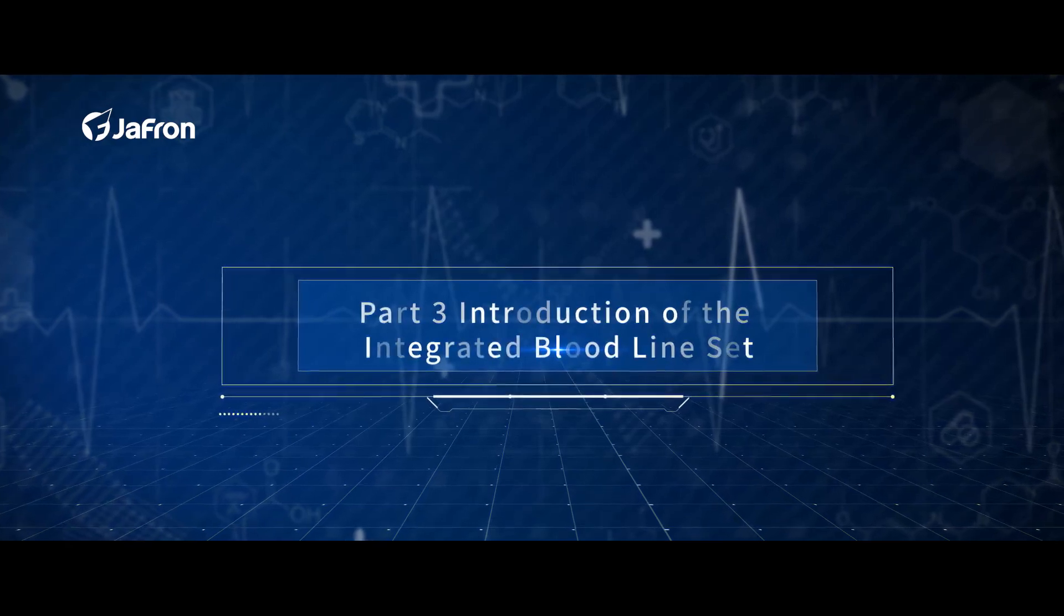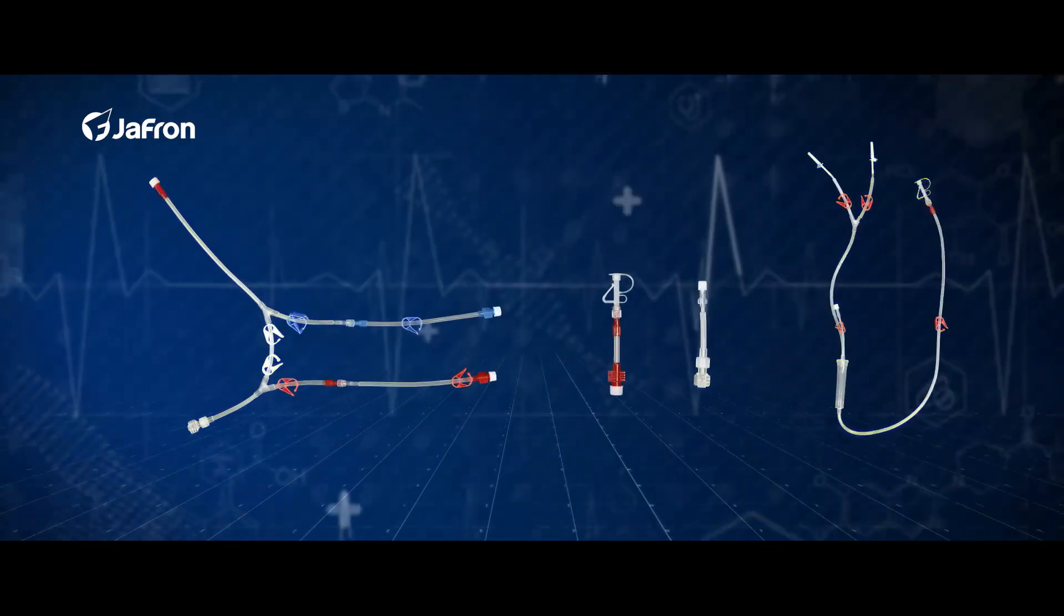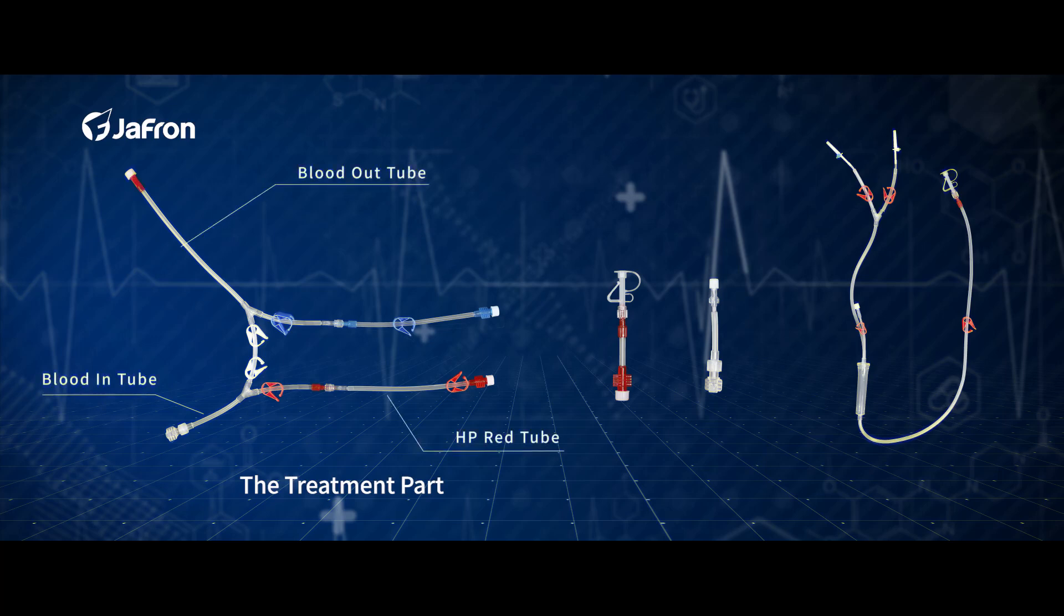Part 3: Introduction of the Integrated Bloodline Set. The Integrated Bloodline Set can be divided into 7 tubes: Blood In Tube, Blood Out Tube, HP Red Tube, HP Blue Tube, Blood In Plus Tube, Blood Out Plus Tube, and Priming Part.